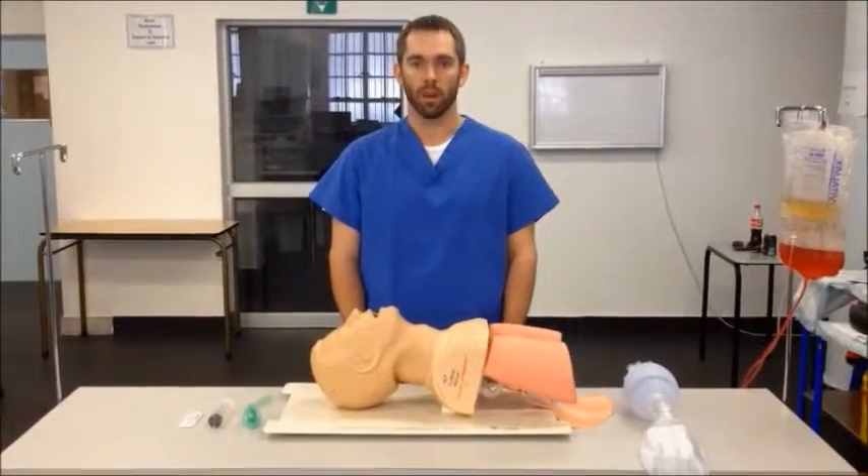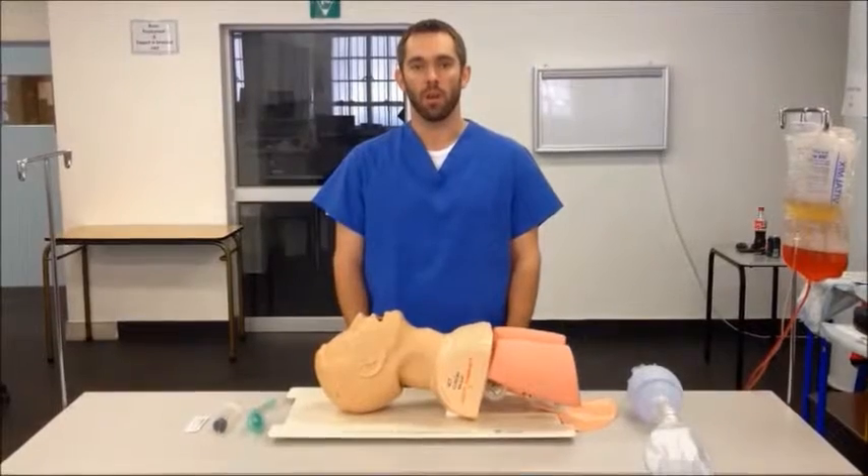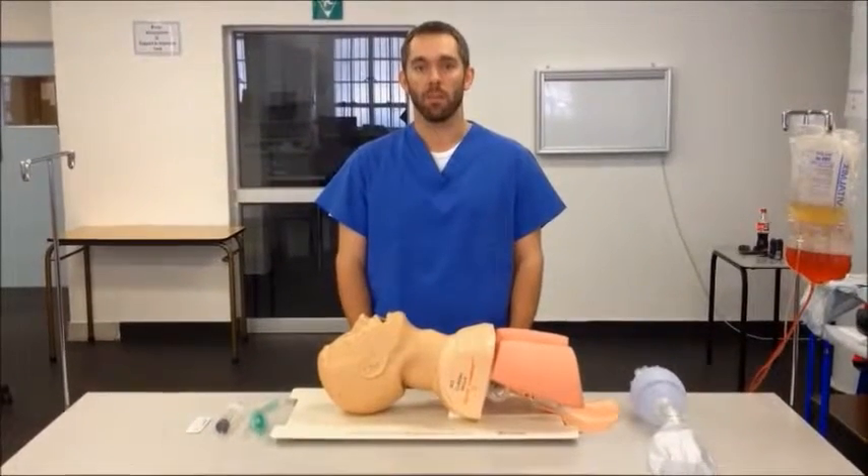An LMA is a supraglottic airway that can be used for the non-definitive management of the airway, or as part of a difficult airway management algorithm.